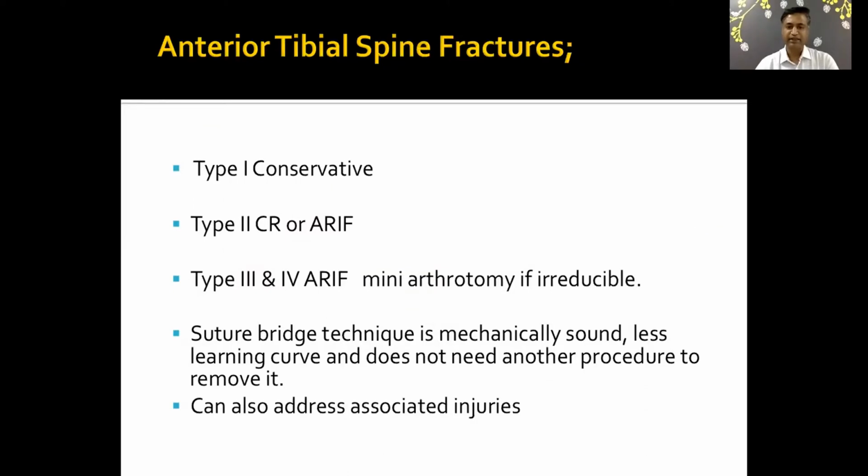The suture bridge technique is mechanically sound, it is a reproducible technique with less hardware, can even be done in the pediatric age group with open physis, and also you can address the associated injuries at the same time.